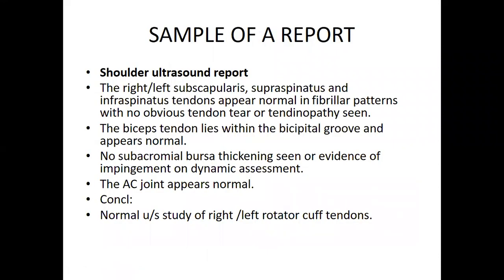I also wanted to share a sample report. There are a number of reports that we may come across, but for the sample I'm sharing, I'll quickly look at the things you're supposed to look at.